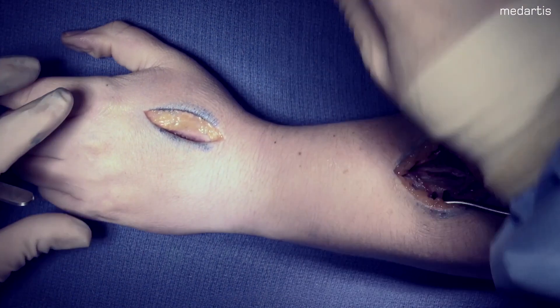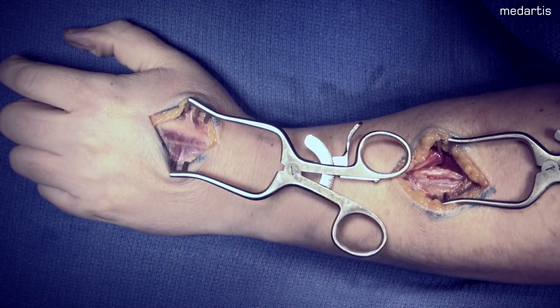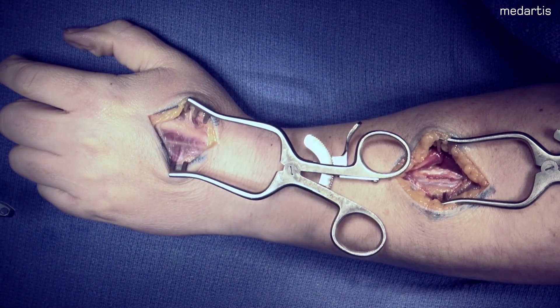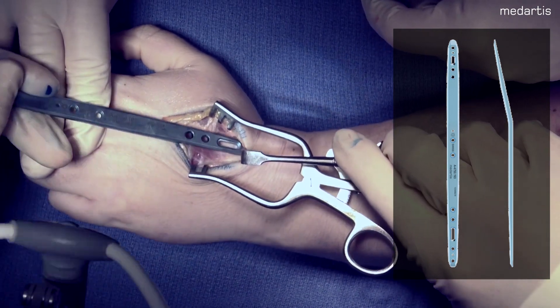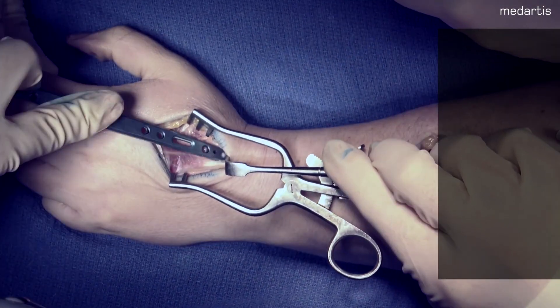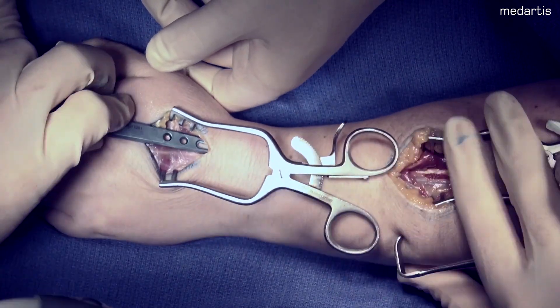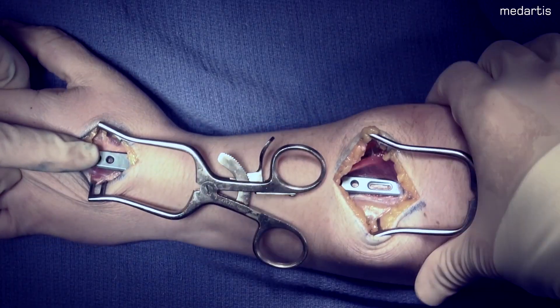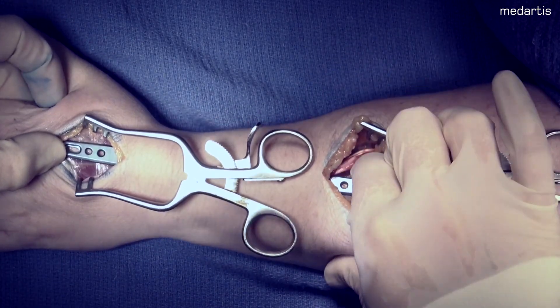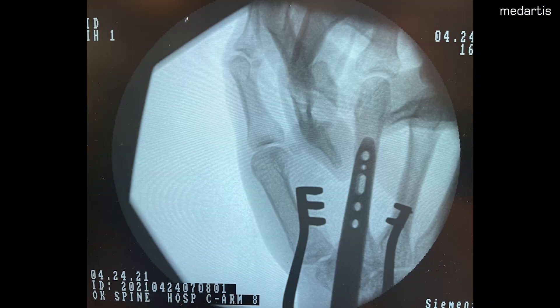Chapter 2: Plate Placement. The plate accommodates a consistent screw diameter of 2.5 mm for intraoperative simplicity. There is a 12-degree dorsal bend for neutral hand position and for power grip. Note the holes overlying the distal radius for additional fixation options. Now we will take our plate and place it retrograde, and here it is proximally on our radius. We confirm this positioning under fluoroscopy before securing its position.